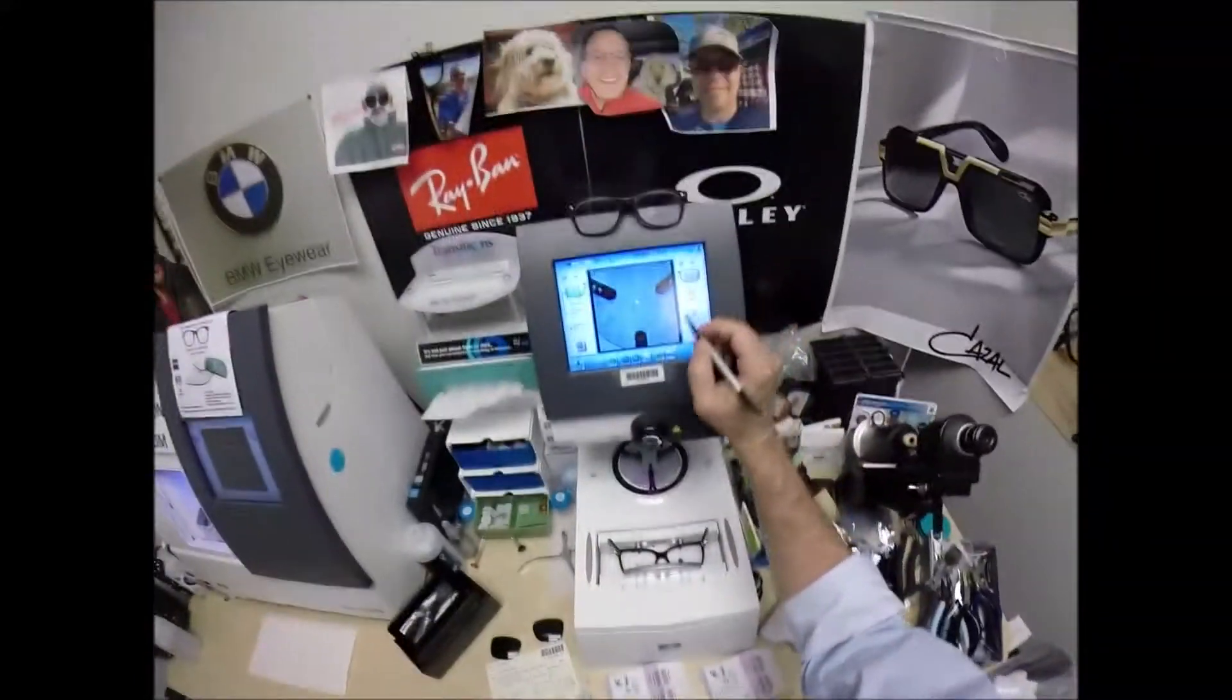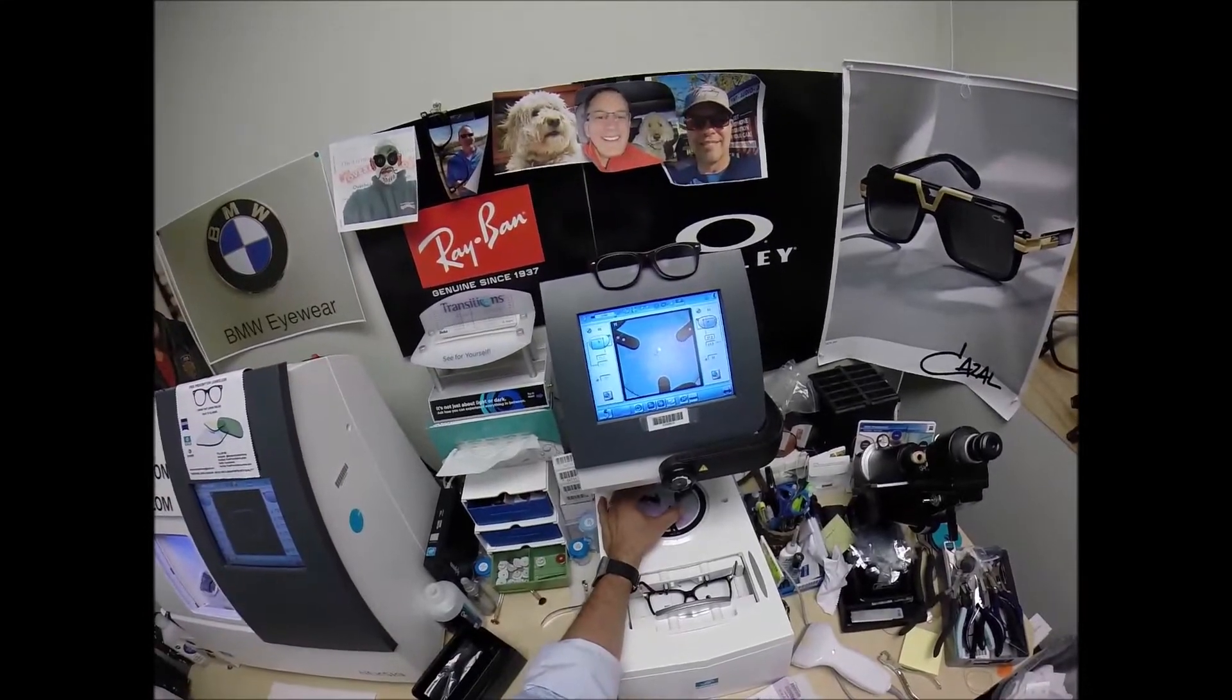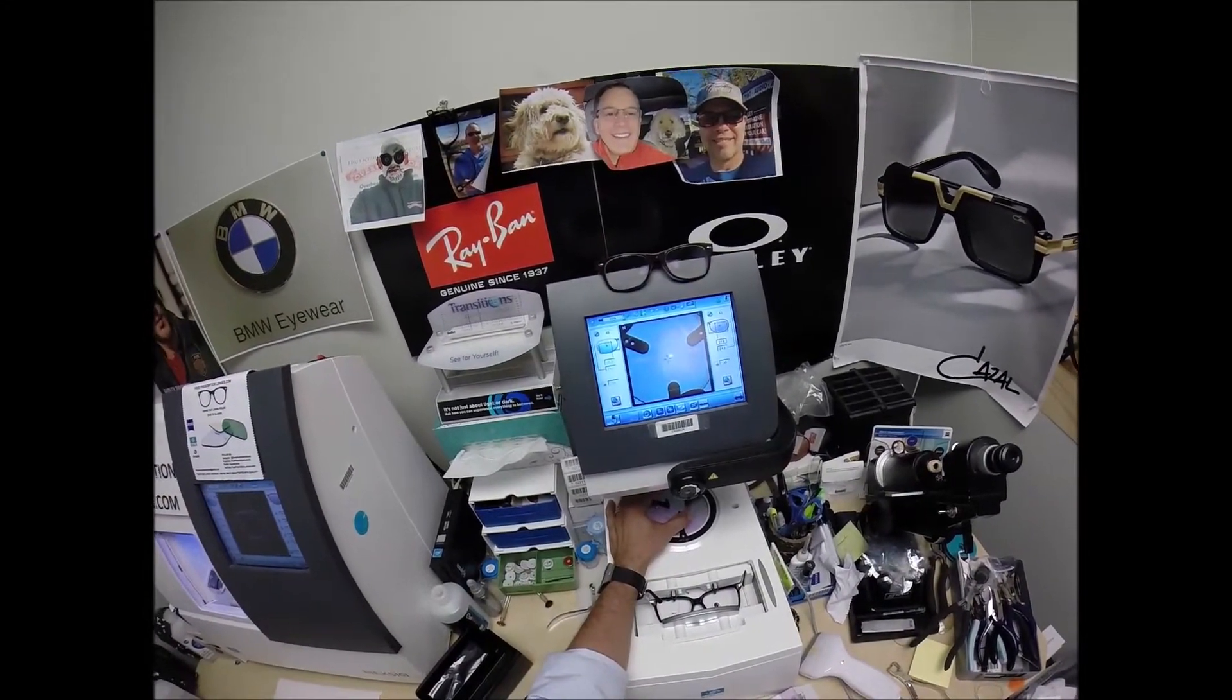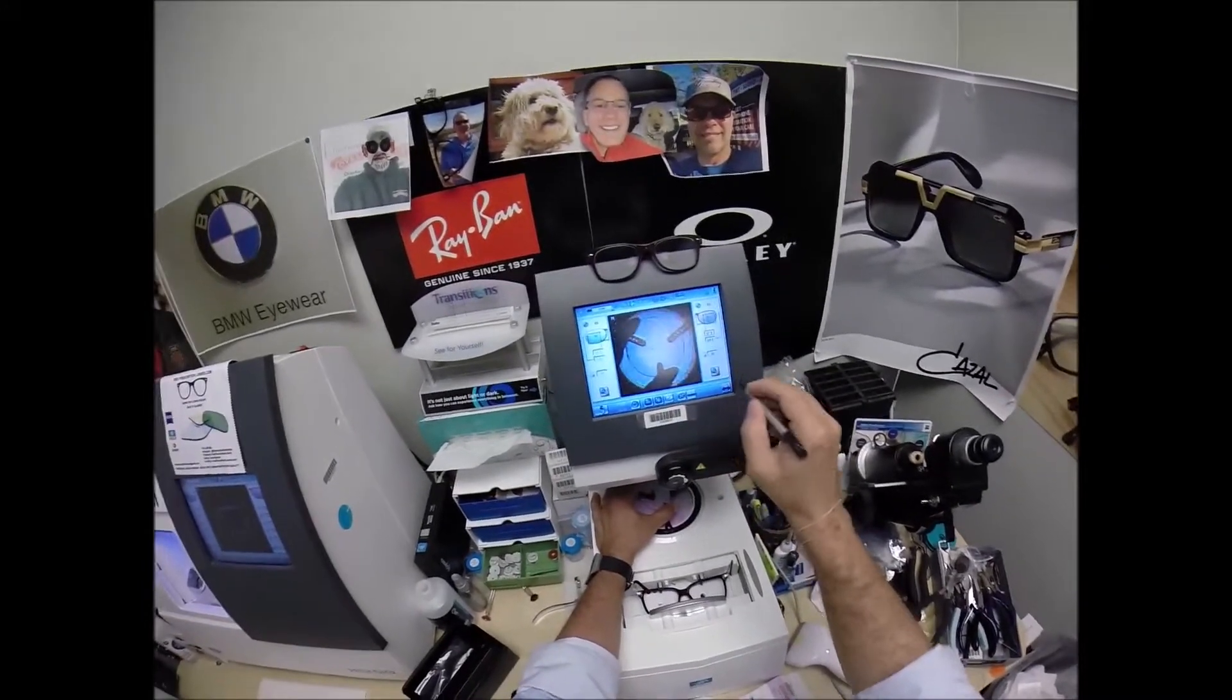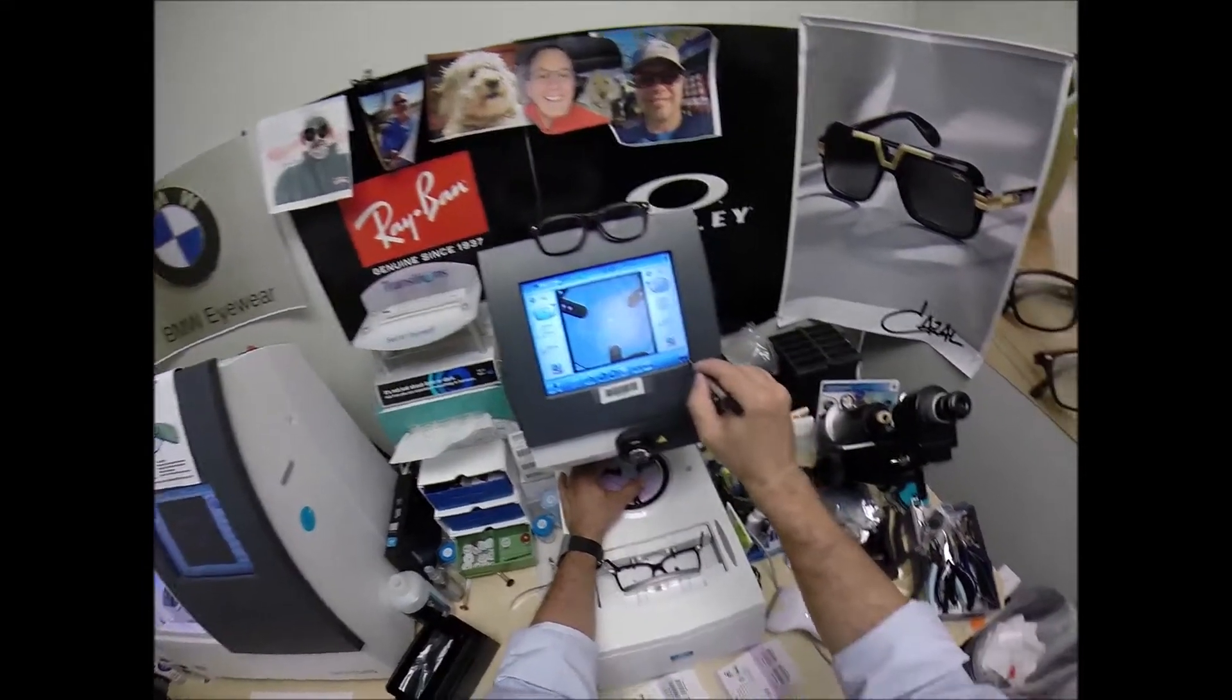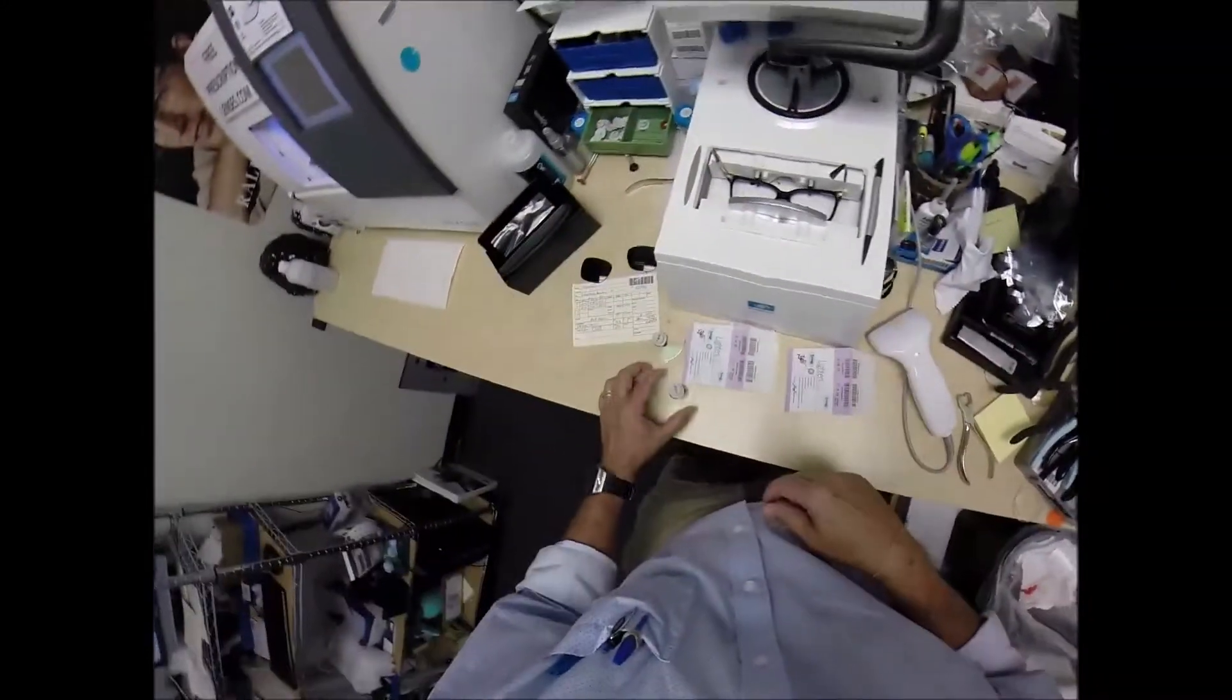The pupillary distance for the left eye is 37. I'm going to raise that up there. Get that laid out just perfectly. Make sure the lens is large enough. And it is. Hit that button. The arm comes down. Places the block onto the left lens.